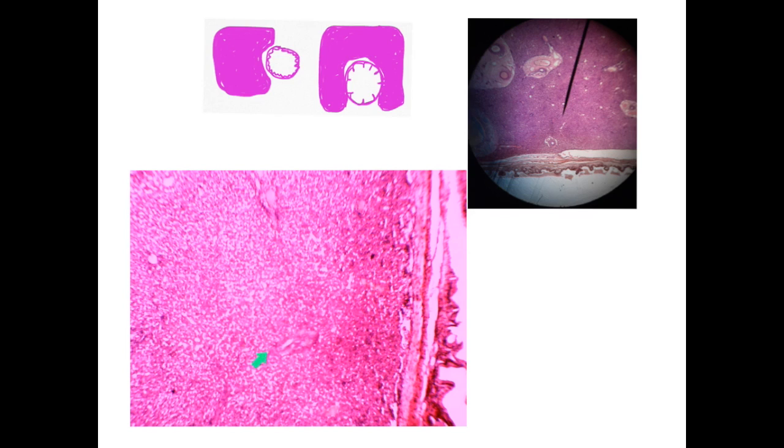Also here, this is the liver. We have the central veins, no landmarks for the hexagonal lobules, and this is the folding of the mucosa of the hollow organ accompanying this liver tissue.